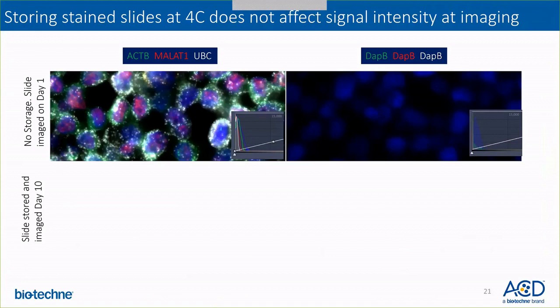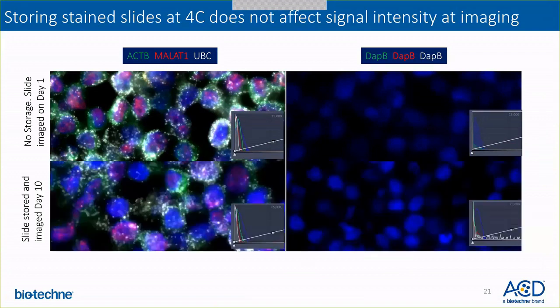Another question is: does the signal get affected if I store the slides? Storing the stained slides at 4°C does not affect signal intensity. As you can see here, in the top panel the slides were stained and imaged on day one, and in the bottom panel the slides were stained, stored, and imaged on day 10. The signal-to-noise ratio looks pretty comparable, and there is no effect of storing the slides at 4°C.